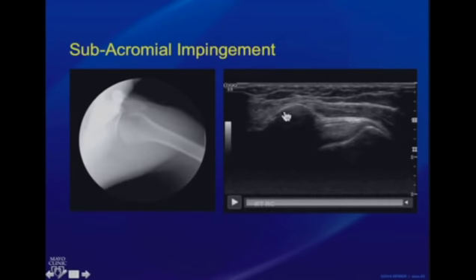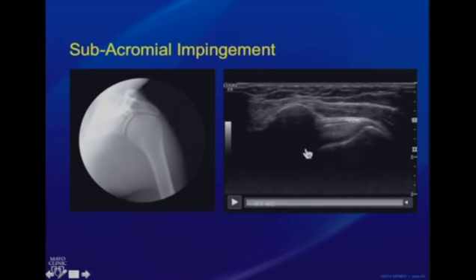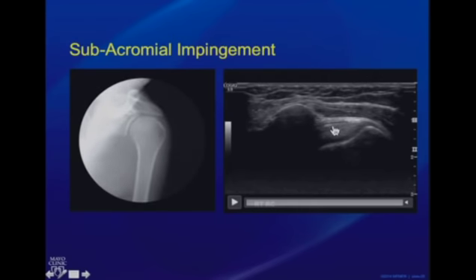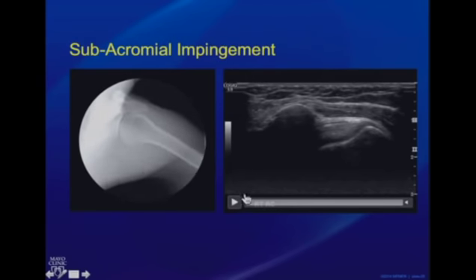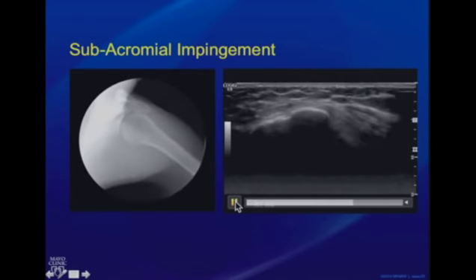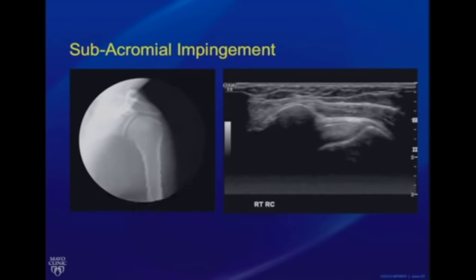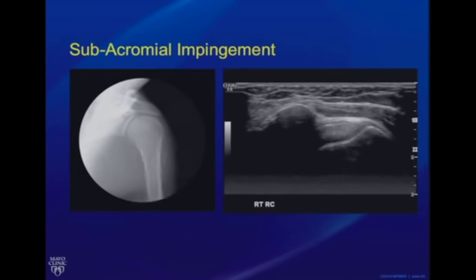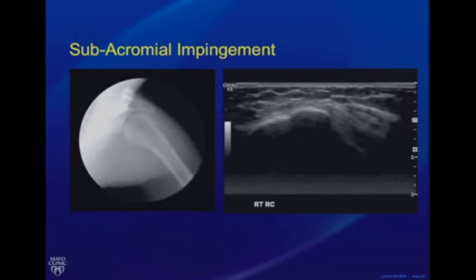In a coronal plane, keep the acromion in view and then make sure you have part of the cuff and the arm is hanging by the side. When the arm abducts, you're looking for how much of this cuff actually goes under the acromion. And here you can see the entire cuff, including the bony landmarks, slides under the acromion really well. So in this case, there is no impingement.